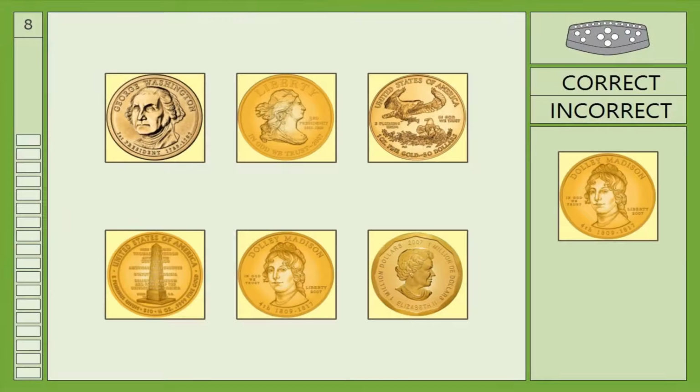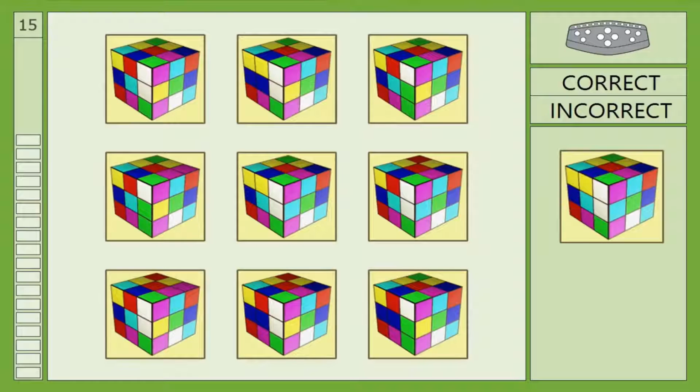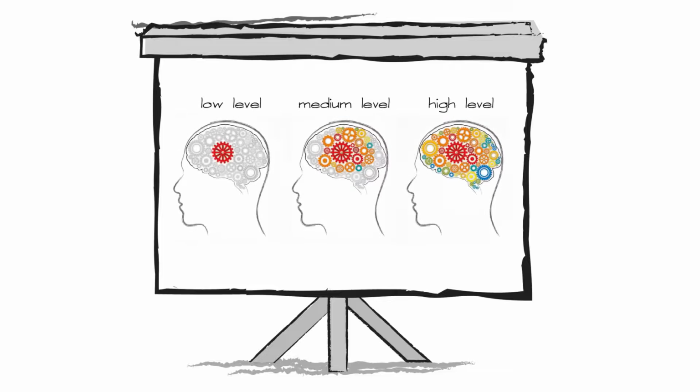This image shows attention and concentration in level 8. There are more pictures. They are closer in appearance, but still easy to recognize. On level 15, attention and concentration reaches a difficulty that patients with severe cognitive deficits can't handle anymore. In this range of difficulty, the therapy module should be used by patients with middle and mild cognitive deficits.